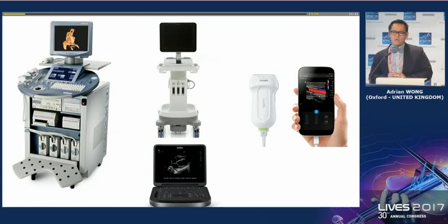Ultrasound, I think, has become more and more prominent because it's become more and more easily available. This is your bog standard, large radiological department ultrasound machine, and they've gotten smaller and smaller. Hands up those of you who've got these sort of things in your unit. Minority. What about these ones? I make that to be the majority, although not quite 50%.